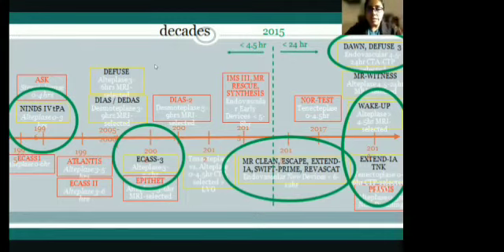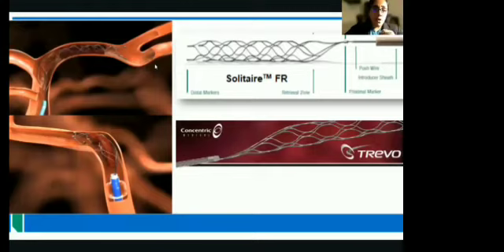We just investigate and see if the patient can still have the thrombolytic agent or not. And thanks to these advanced retrievers, this is a clot retriever where you can essentially negotiate inside one of the branches wherever there is a clot, and pretty much you can remove the clots.